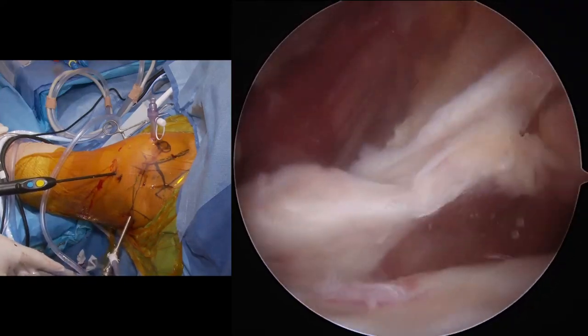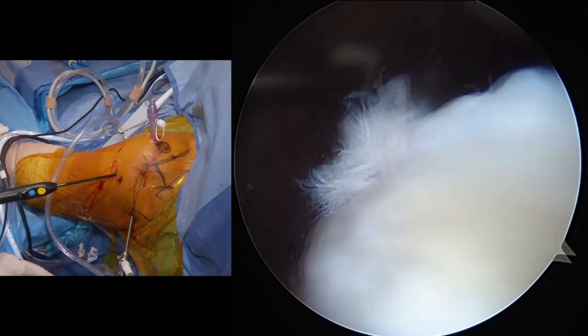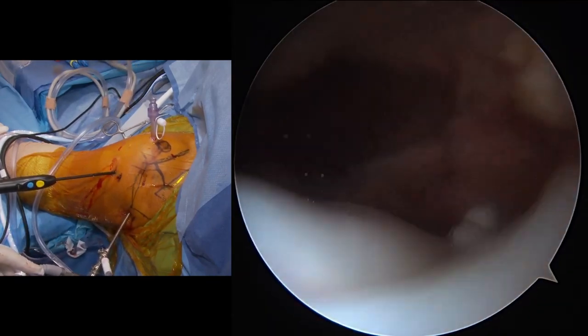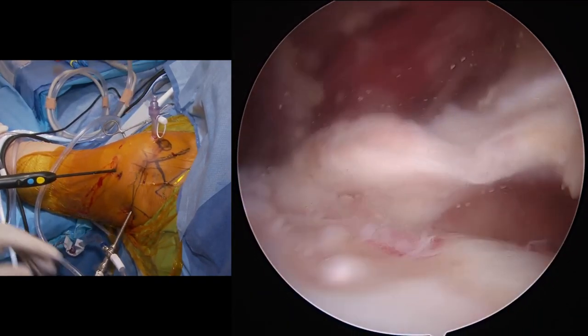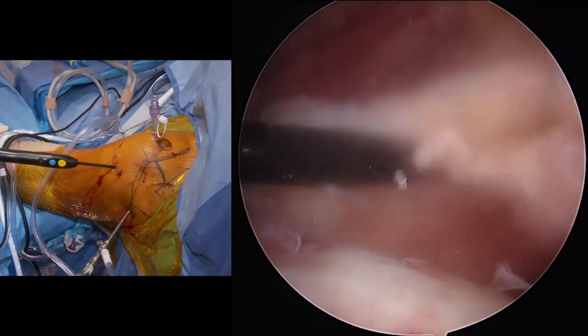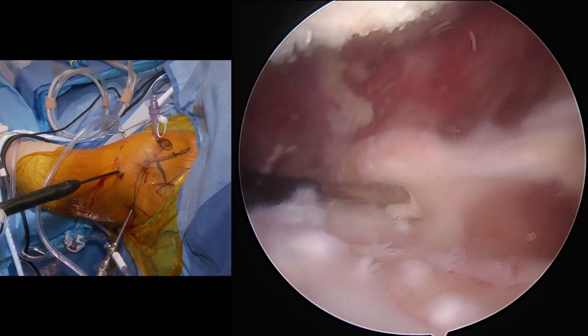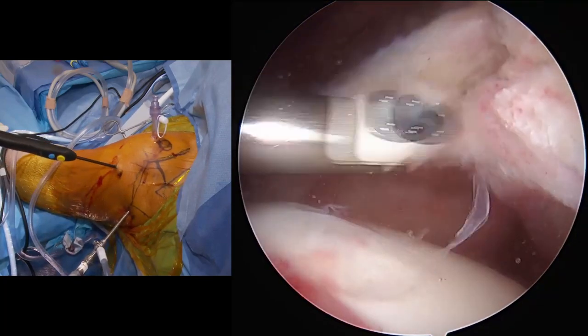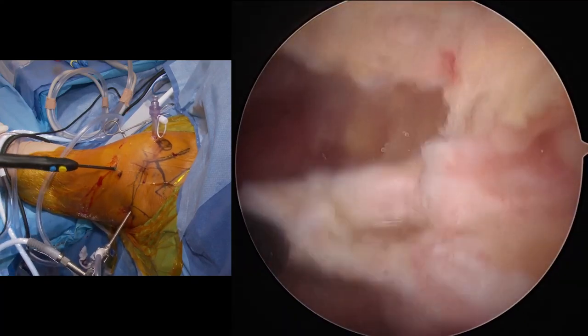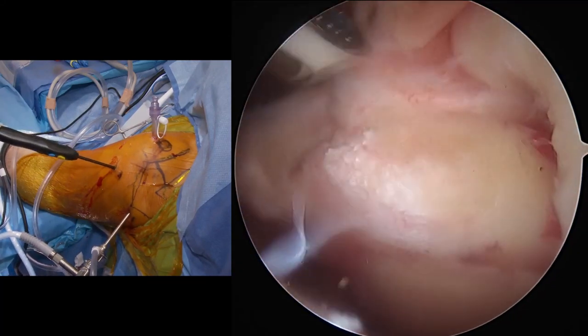Well, he's definitely gone on to have a full thickness rotator cuff tear because that's all off the edge. And we're going to have to find the other part of his rotator cuff because it's somewhere in the back. It moved somewhere. There's a little tissue here. His biceps tendon was there. He definitely had a subsequent injury to the MRI that we have available.